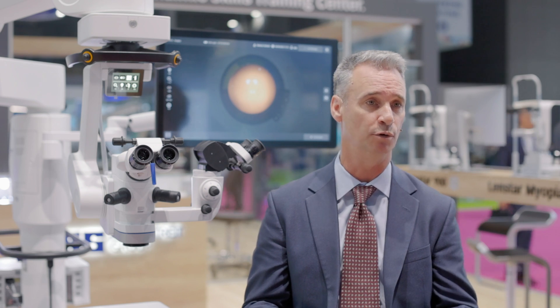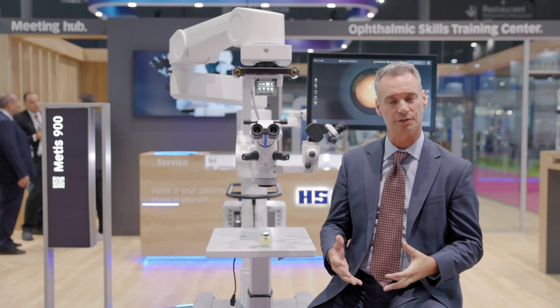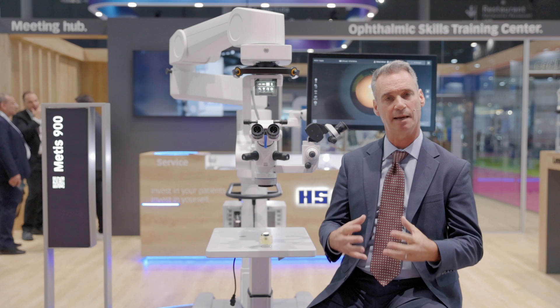Haag-Streit is well known for its optics, and the Metis 900 incorporates all the Haag-Streit optics, providing a clean, crisp, and clear view through the microscope.